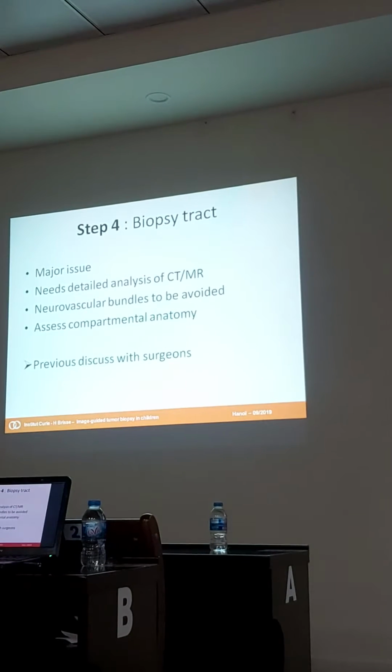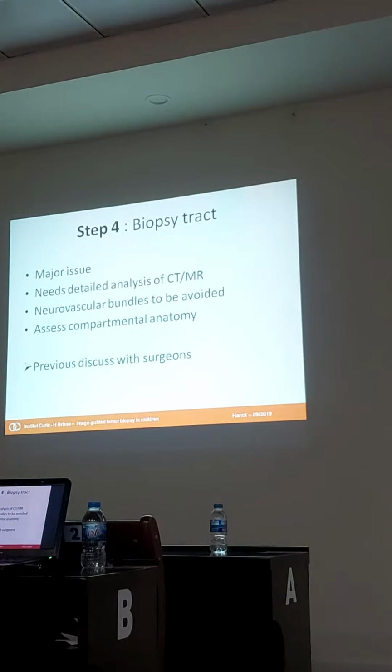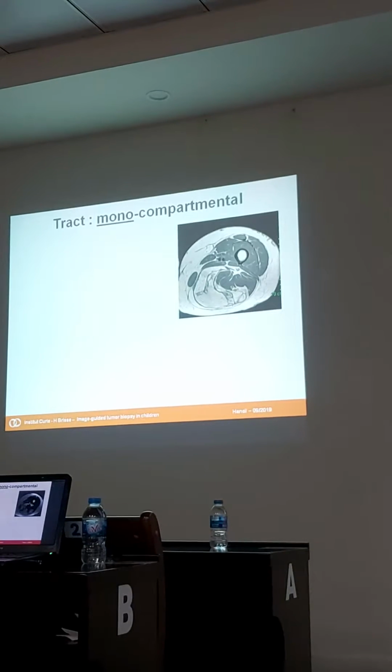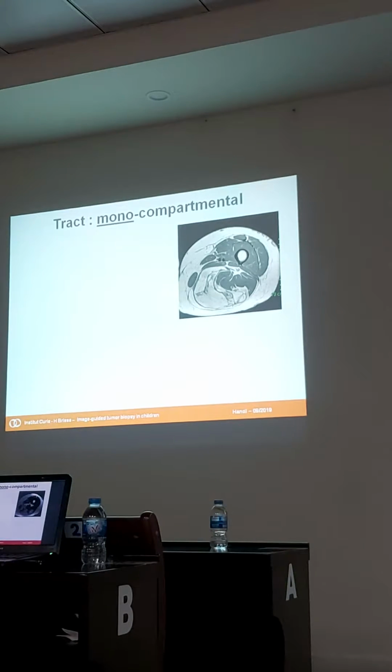So you should clearly look at your images to assess in which anatomical compartment the tumor is located. One example here, you have a tumor of the left thigh. This is a femur, and this is a mass with fat inside. It is an adult, not a child, so it is very suspicious for sarcoma, liposarcoma.